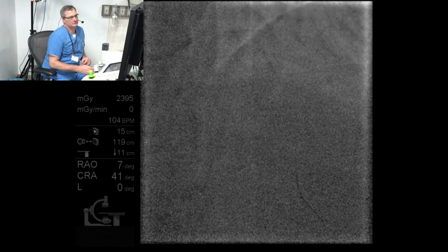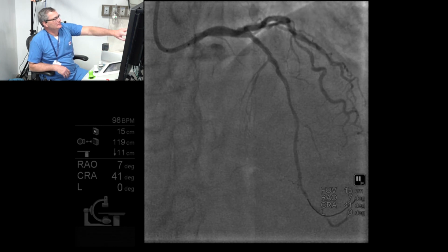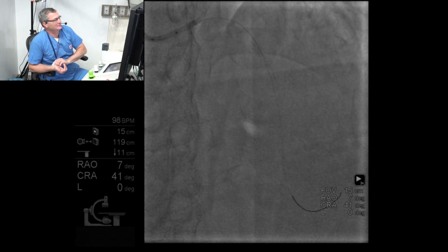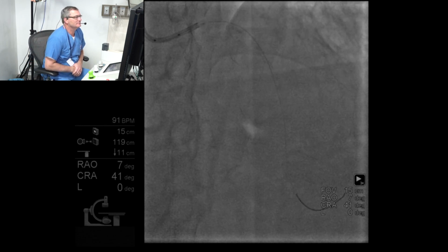Thank you. So what length do you want? Long. Well, actually, if we're going to put a 2.25 in, I think we can cover it all with one stent. Can we get that up to 3.25? Yeah, okay, Onyx will go up. Then the longest you've got. That's our 2.25 longest Onyx long.